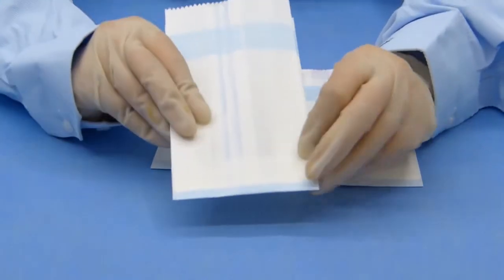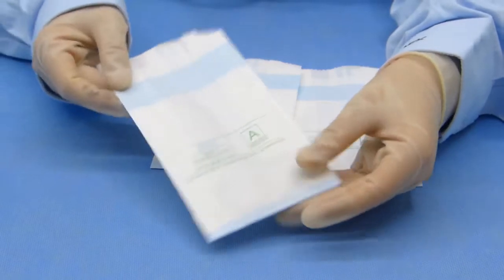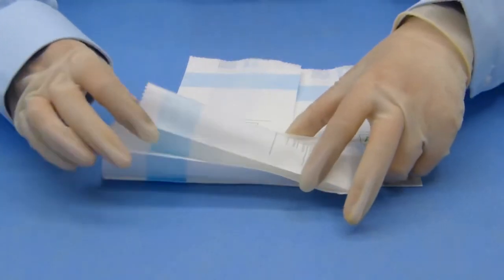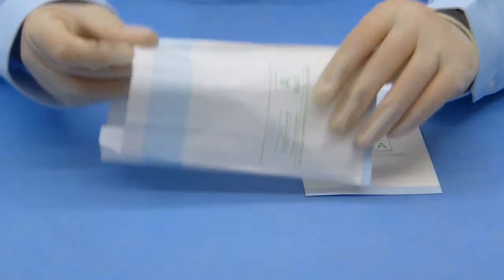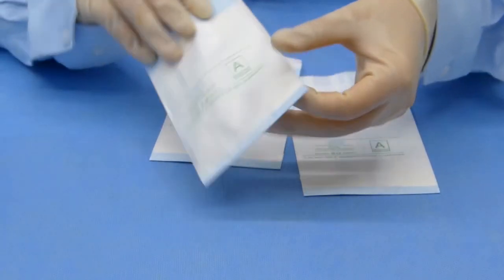Paper bags are used by some hospitals for similar applications to pouches. They can be used either on their own for procedure packs, or as part of the contents of a wrapped tray or basket for holding instruments used during an operation procedure.